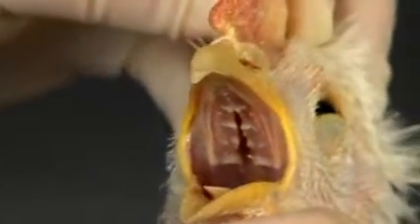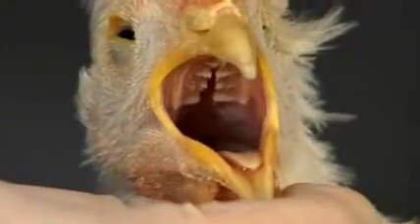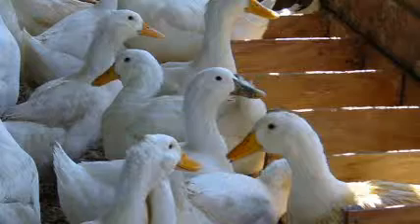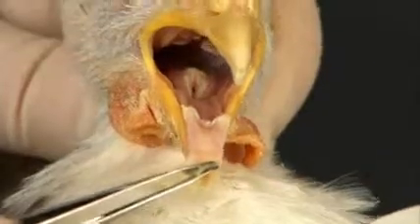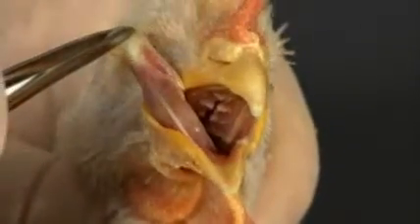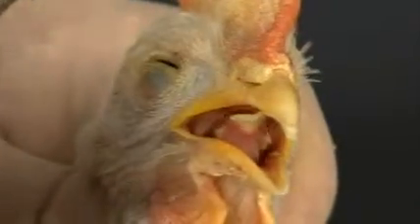For example, yellow pigment in the beak may be lost as the chicken produces more eggs. In ducks and other birds, hormonal changes may also affect the color of the beak. Open the mouth and examine the oral cavity. Pull out the tongue and examine its dorsal and ventral surfaces.